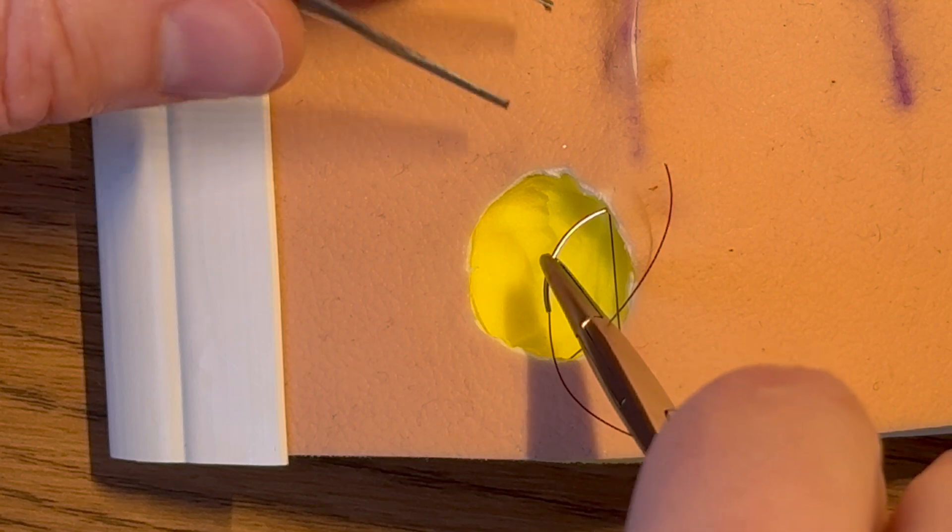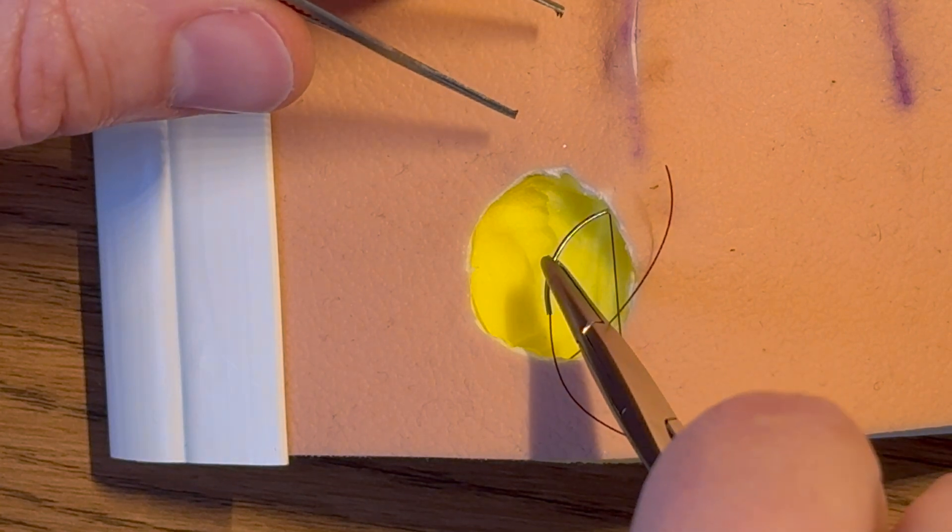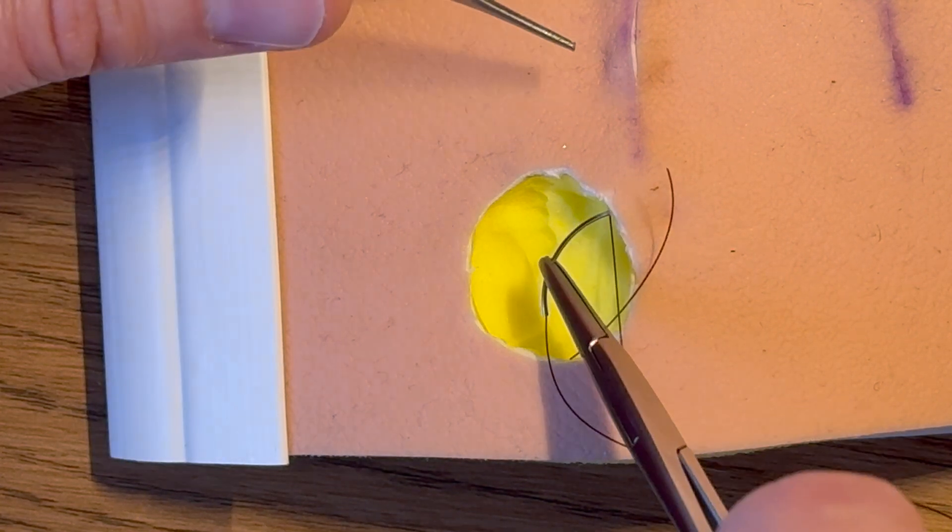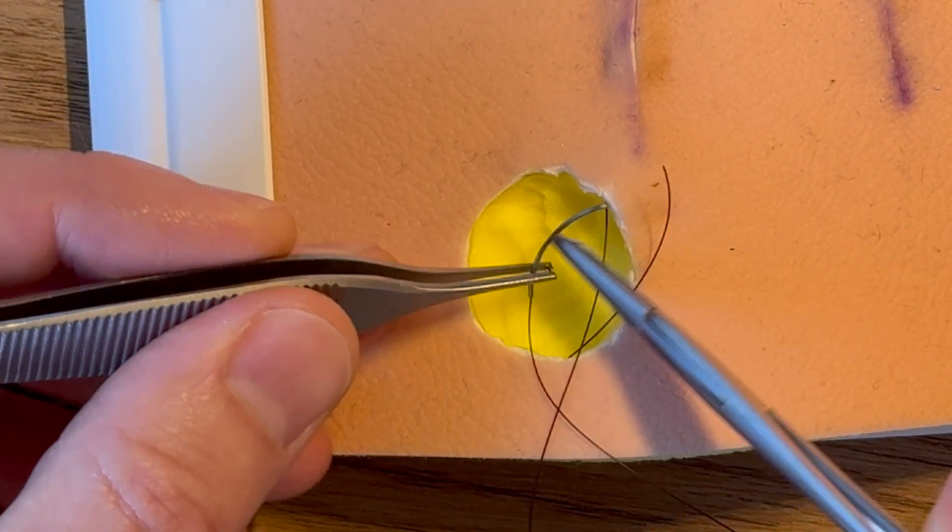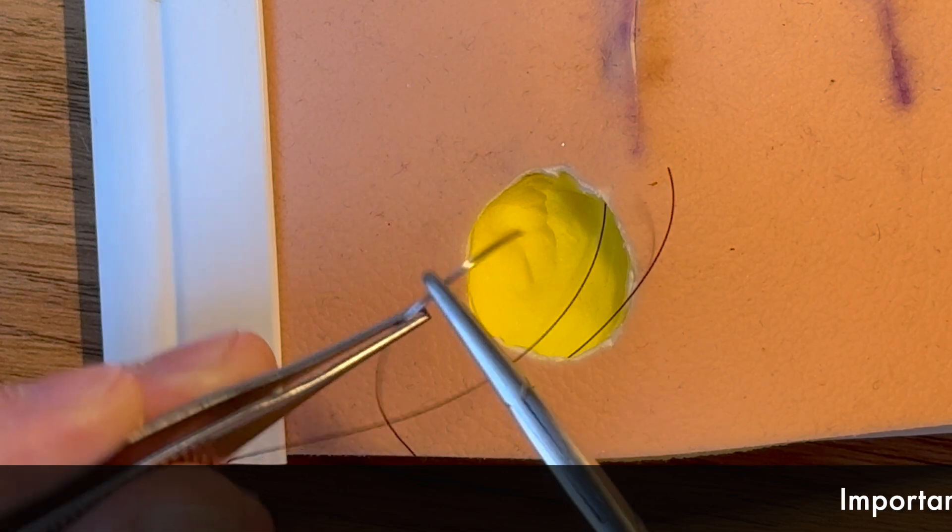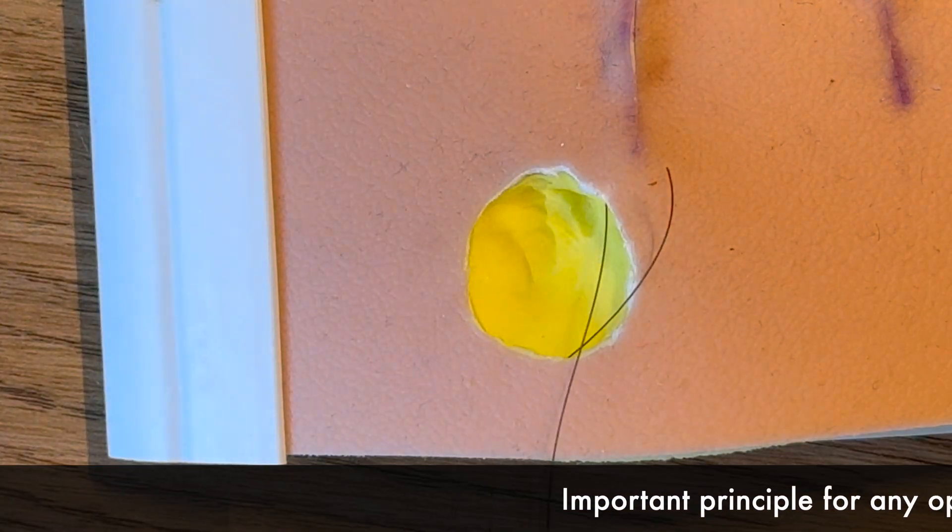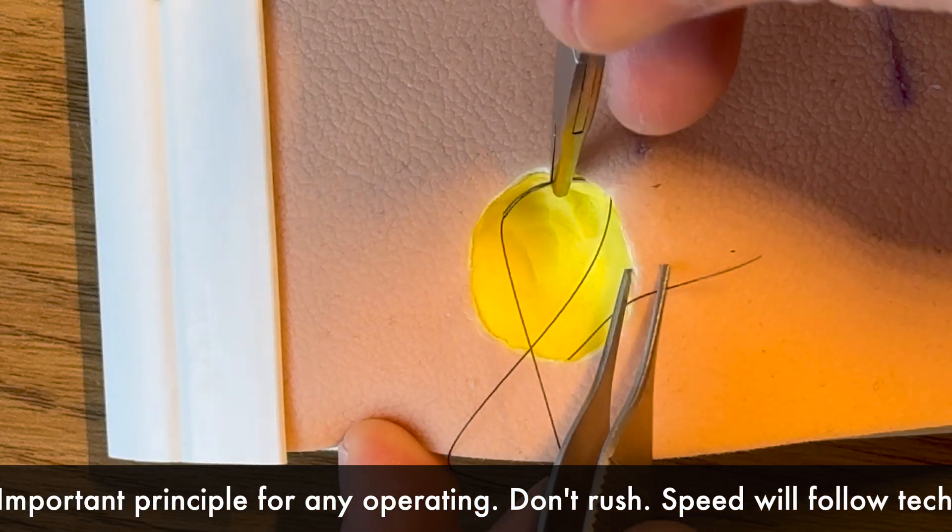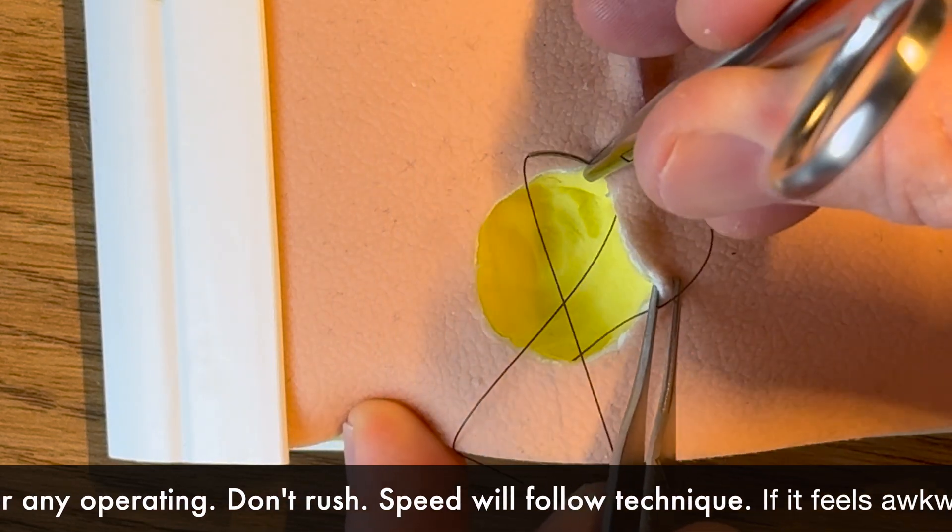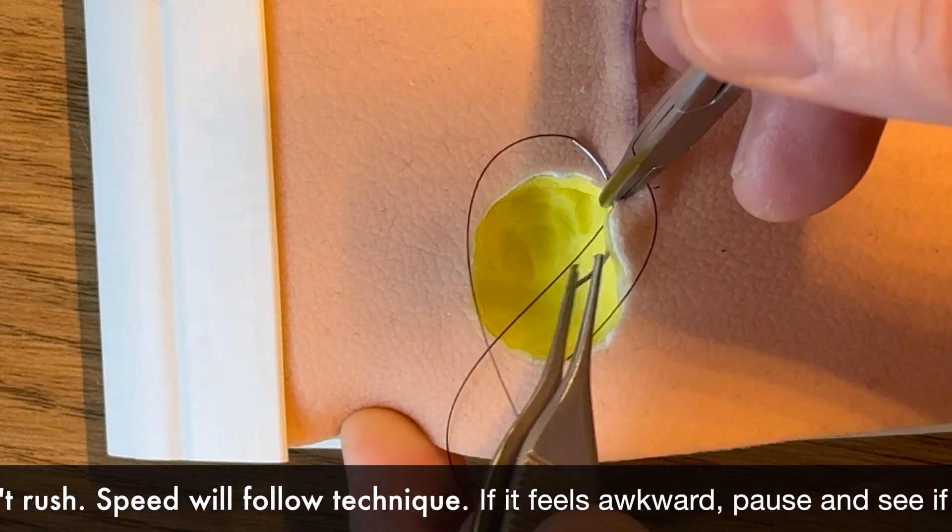So when you do that it's always worth thinking about is there an easier way of doing it, can I reposition myself? So let's move myself around this way, around where the patient would be and make it easier. You see, grab a bit of a dimple.